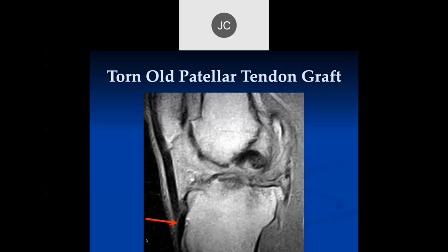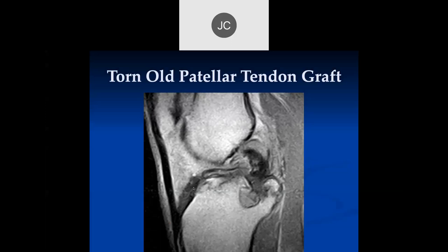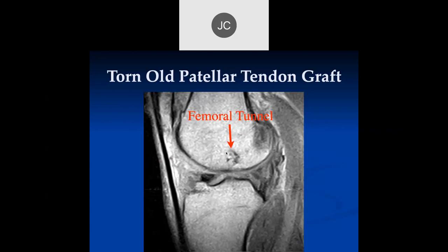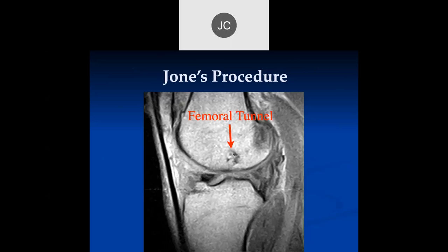Here we can see there's some tendon coming down here to the tibial tubercle, something coming up here. This is actually a native - this is a graft there. And if we keep following this, we can see a femoral tunnel which is not in a very good position. This is an old technique and tensioning it is going to be difficult - it's going to be lax in some positions and not others. That's a Jones procedure where the femoral tunnel was not in a very good location.